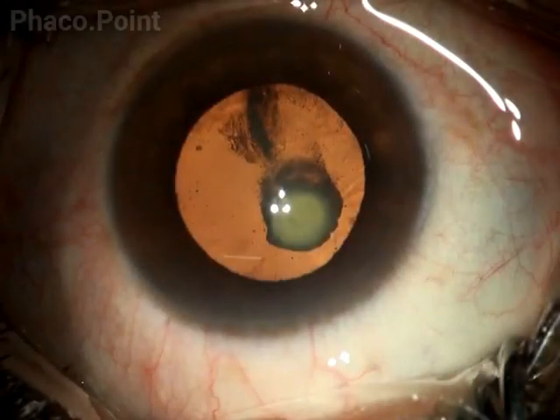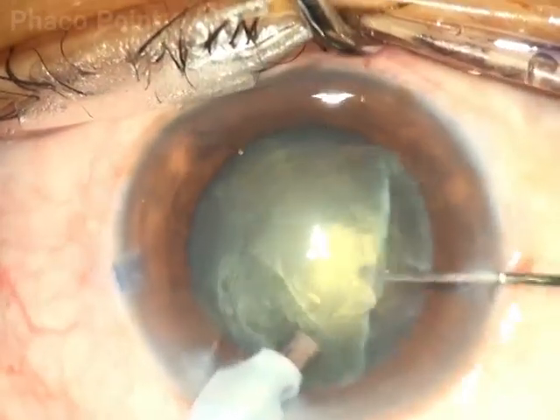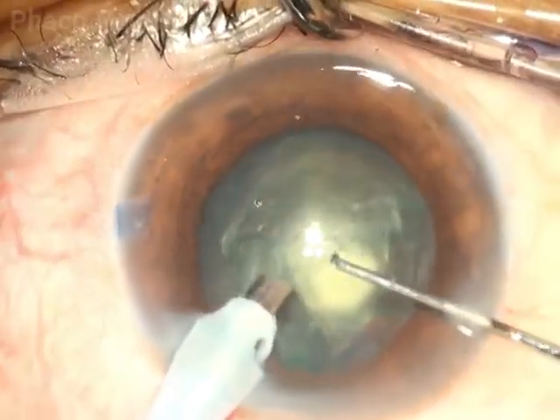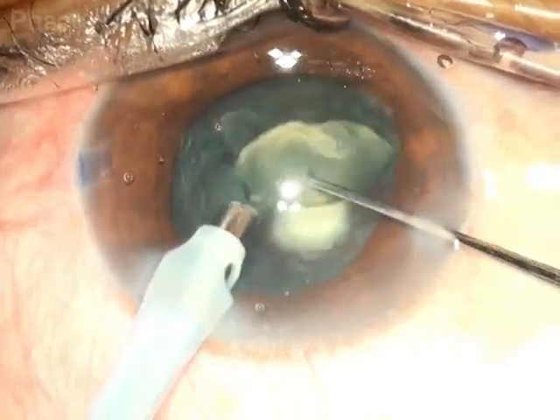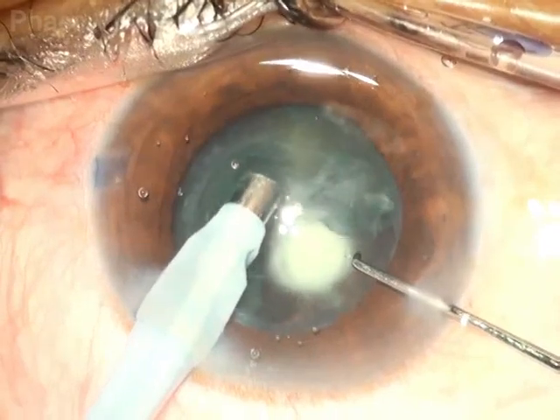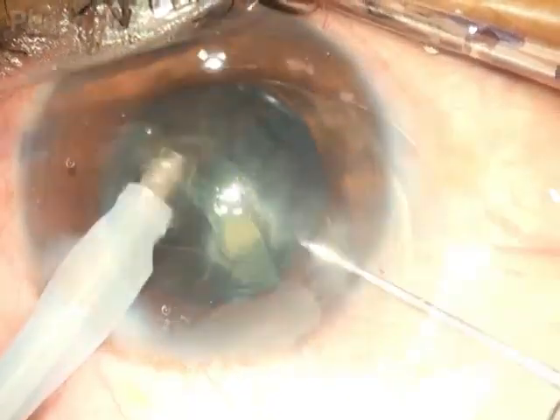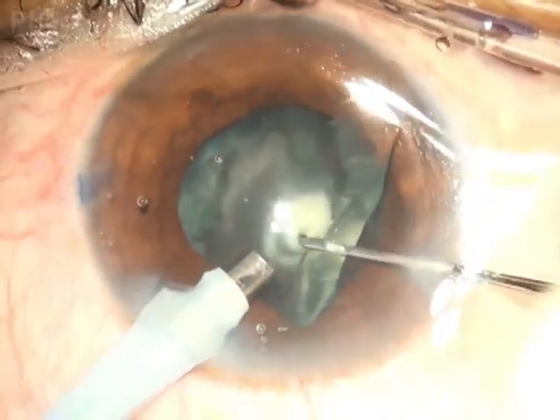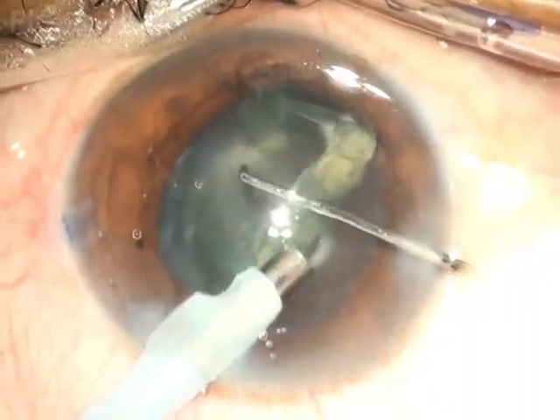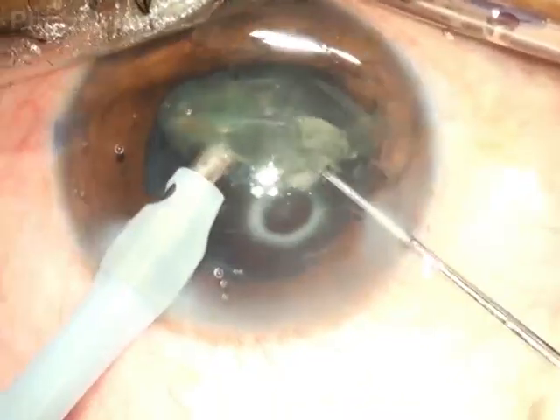It can be even more challenging to deal with a soft cataract which also has a posterior polar element. In this case, the surgeon yanks out and scoops out the central soft amorphous core, then has a resultant epinuclear bowl. With care and caution, without disturbing the posterior pole, the surgeon brings this epinuclear bowl carefully and completely out of the capsular bag and then emulsifies it.